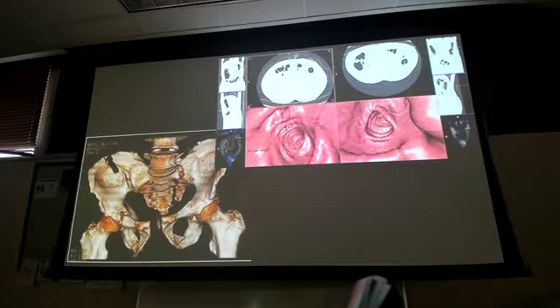So this patient has an unstable pelvis. They wanted to make sure, again, before they go in and probably surgically fix this back, they want to hit all the areas before they go in and do it. So we're starting to get more modalities and that kind of stuff.